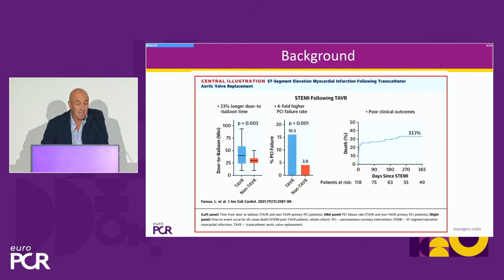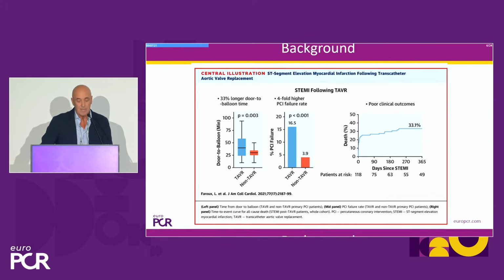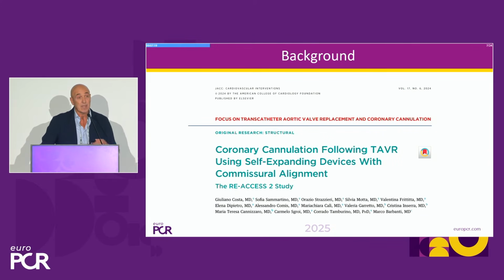For example, in this study, we recognize very well that the door to balloon time is much, much higher, compared to the population without TAVR. And also, the failure rate is much, much higher. And also, the clinical outcomes, of course, if you're not able to open the artery, are much, much worse. So we have to consider that when you are treating young patients. And the second very important point is that when we are using supra-annular, self-expandable TAVI, we know that even in a non-acute situation, the reaccess could be difficult.